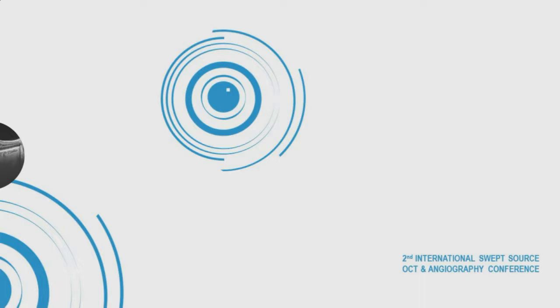This is a very good presentation, but let me ask you, you said it could be a MACTEL or it could not be, but I agree, in my opinion, it's not. It would be too large a spectrum. And usually in MACTEL, you also have a huge rarefaction of capillaries. This is not the case. So what is your opinion, Wick? Do you have an idea?